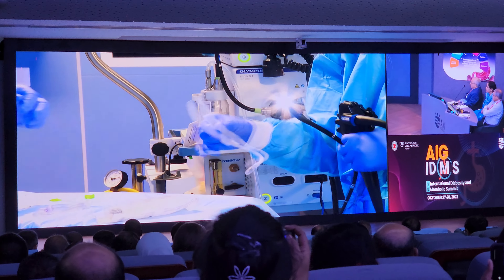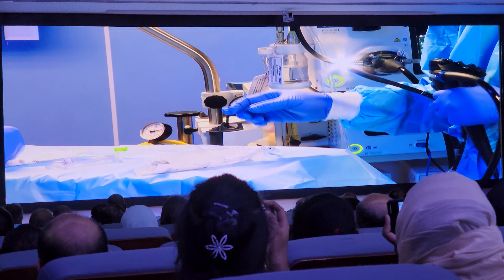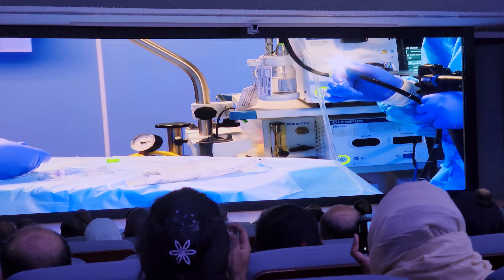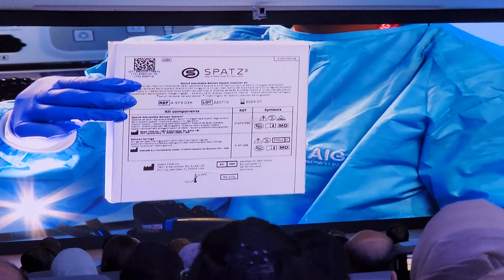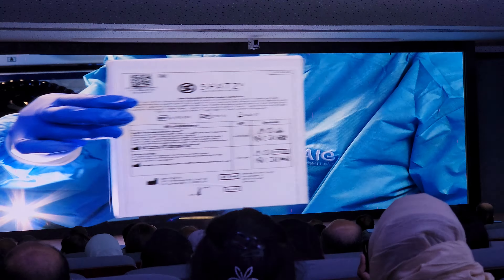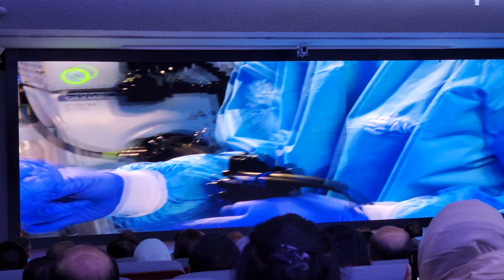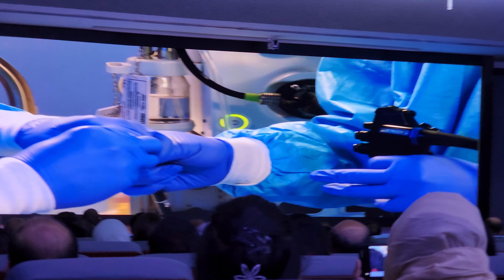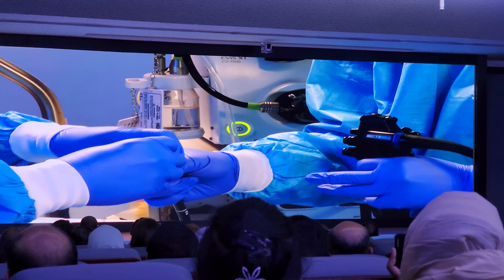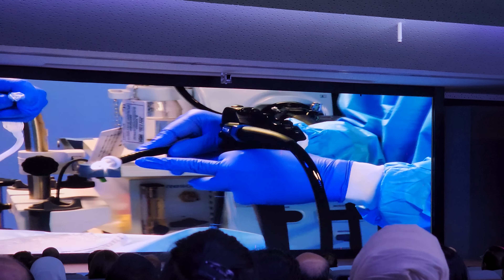Once this covering gets opened, and inside is the material that we have shown you. Please notice the facilitator — it is very important because that is how Saransh is going to introduce it. This is a facilitator being threaded on.